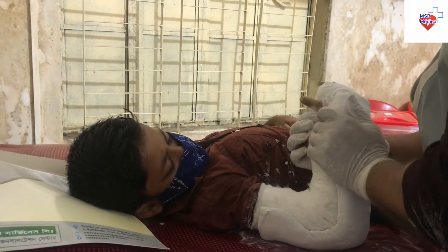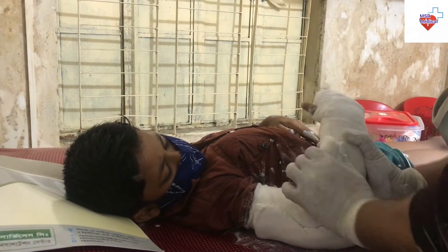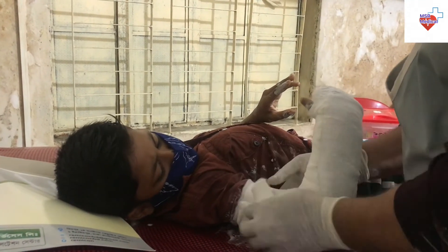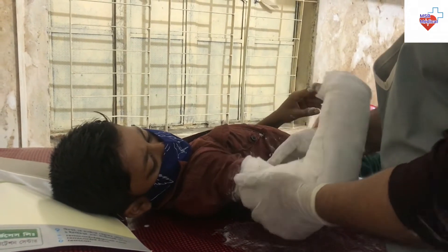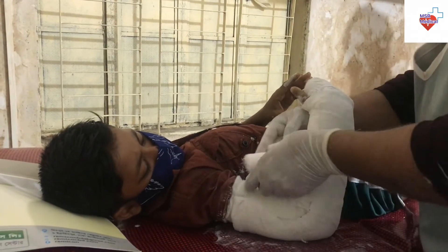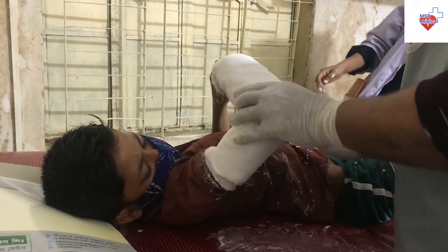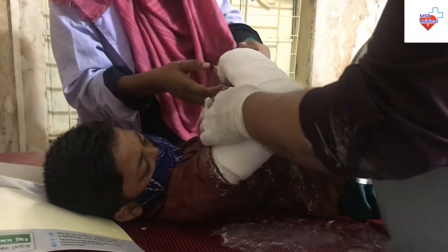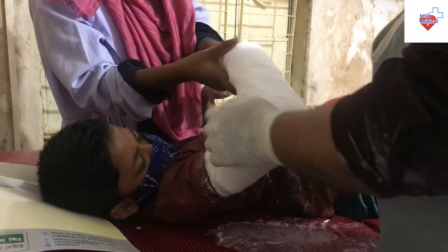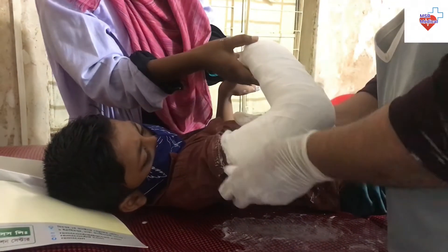Overwrap the splint with 2-inch flannel from distal to proximal, first in a criss-cross manner around the hand and wrist and then proceeding proximally. Tension the flannel appropriately to prevent bunching, but avoiding excessive compression of the limb. Wrap the flannel around the elbow in a figure of 8 pattern, ensuring full coverage of the underlying plaster. Continue wrapping proximally to cover the full extent of the splint.